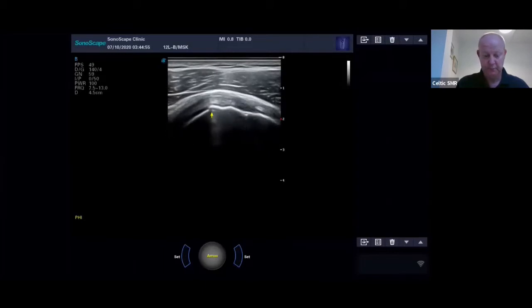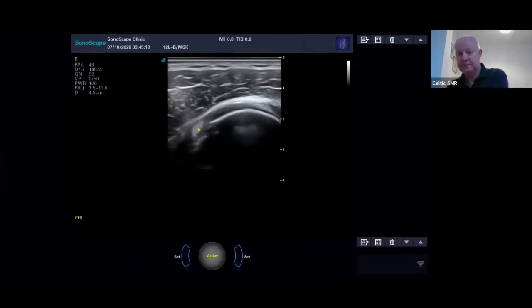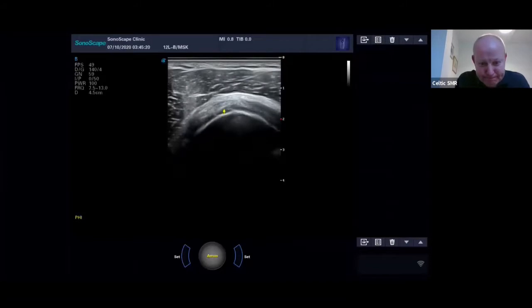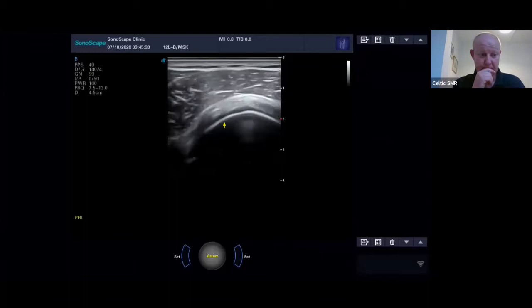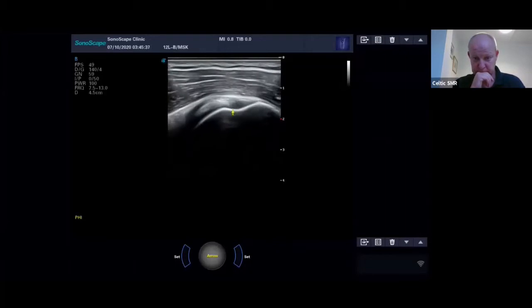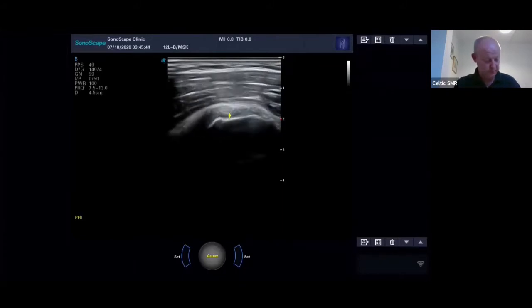Okay, and then if you pop your hand behind your back from where it is, and actually we'll go for the modified crass position, so just there. And that allows me to get down to the biceps tendon here. Supraspinatus, as I say, find the anterior facet, middle facet, so this is supraspinatus here. And then that goes under in front. And then scan all the way through that, also in long section. This is quite a common place to mistake tears, but just make sure you fill them in, get them nice and bright, get rid of any anisotropy to make sure there aren't any tears there.